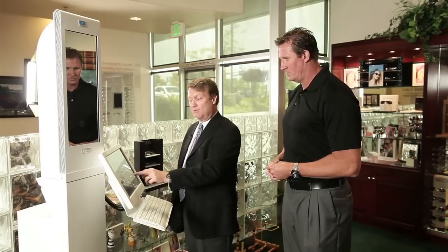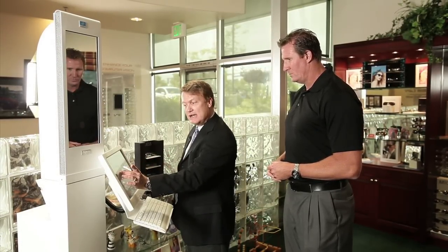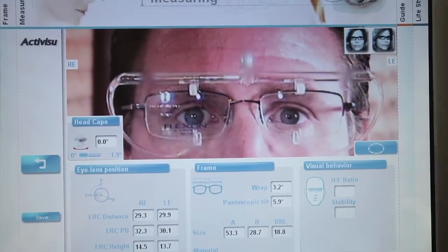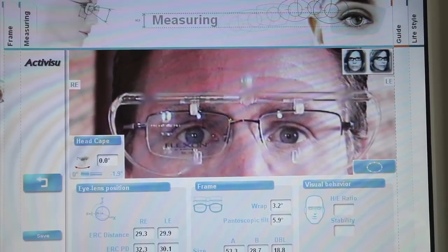Like any new piece of equipment, the more an ECP uses the VisiOffice system, the more confident and comfortable he or she will become in navigating the software, taking measurements, and reviewing the educational demos with the patient. Be aware that measurements taken with the VisiOffice system can and will be different than measurements taken with a manual tool like a PD ruler or even a pupilometer. It is always recommended to provide the laboratory with the measurements taken with the VisiOffice system for the most precise and accurate product.